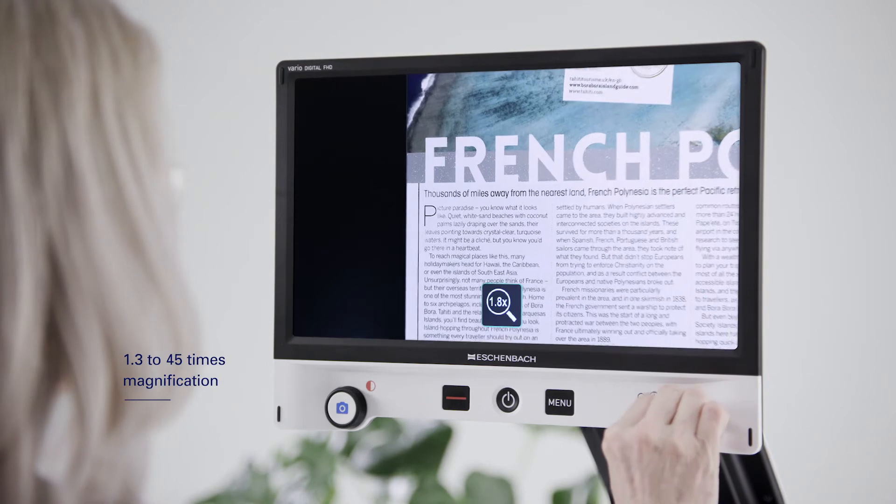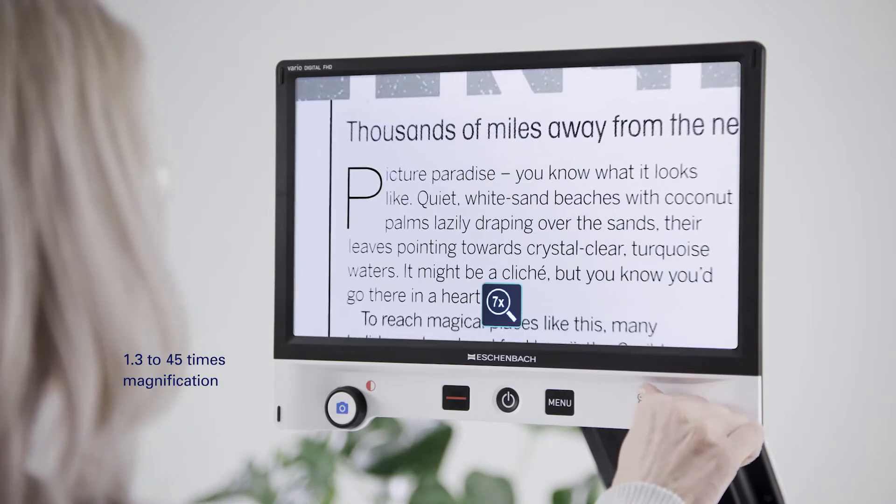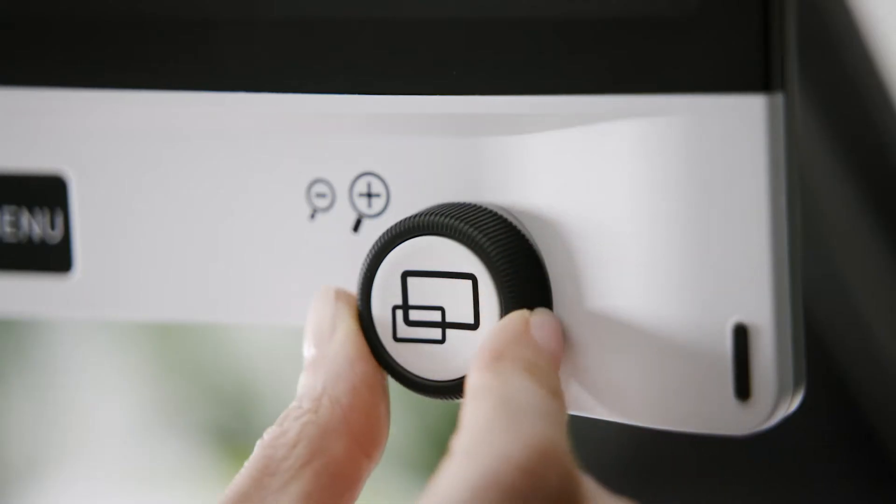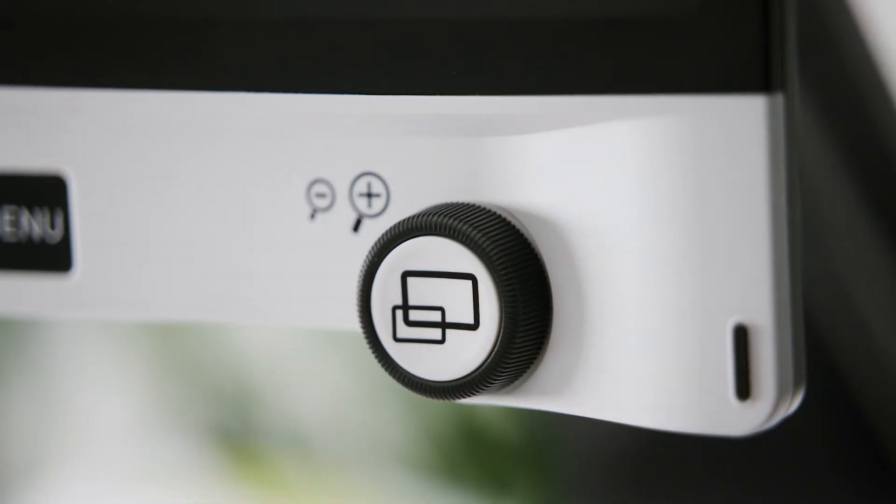An optical digital zoom provides you with 1.3 to 45 times magnification. You can achieve the magnification you require simply by adjusting the rotary knob.